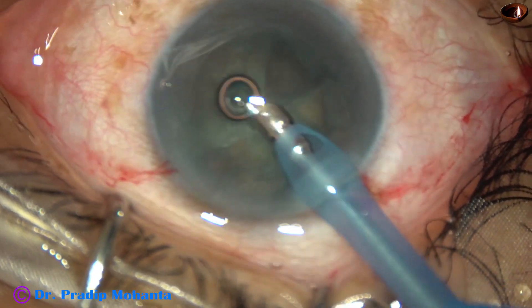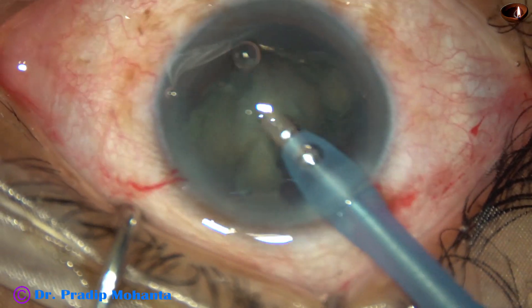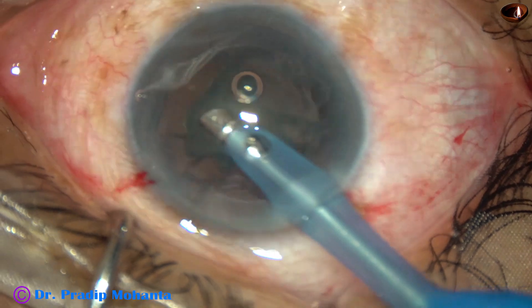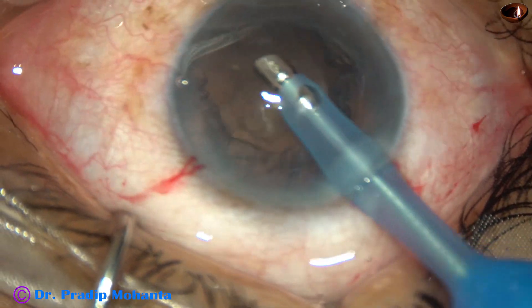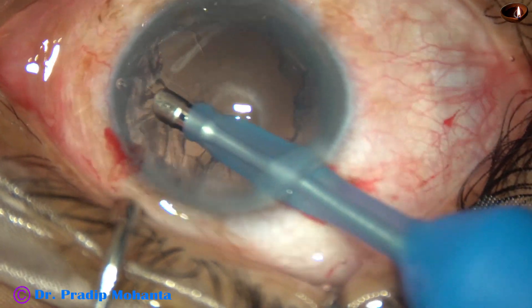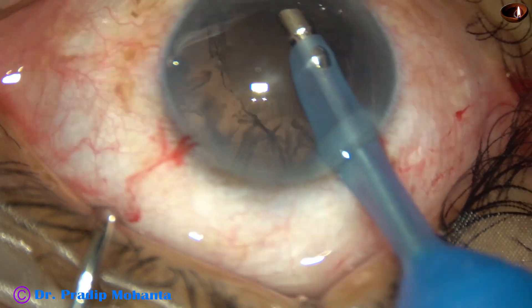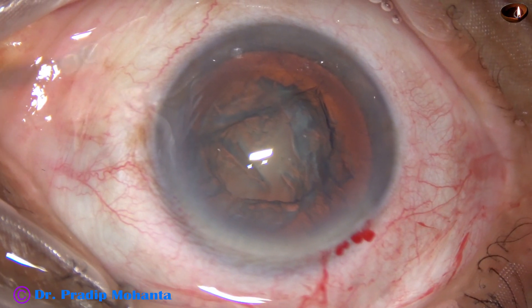See how easily we can pick up the nuclear pieces. In this case, I am not even using the chopper. All the pieces have come out and now the epinucleus is also removed to some extent. The rest of the nucleus and cortex can be managed easily.